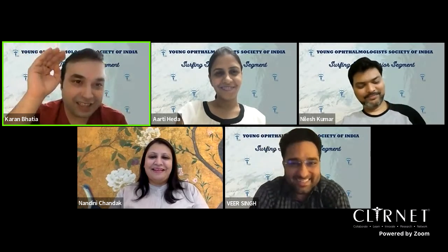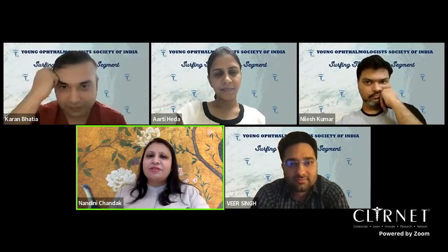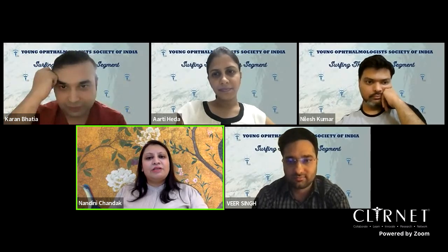But I don't have any experience in iris claw lenses. You can do one, you can do the other, and teach the third. It is that simple to do. Right. And with iris claw lenses, the enclavation and the de-enclavation, as Rikunj had said, the de-enclavation is actually very less.